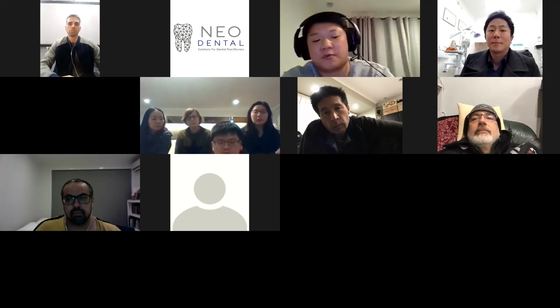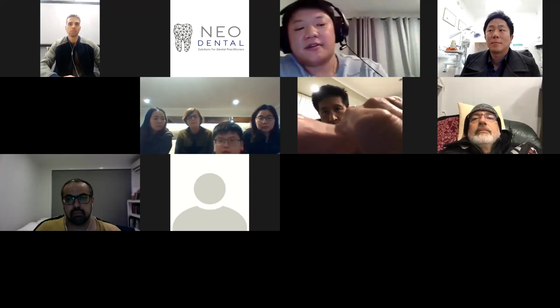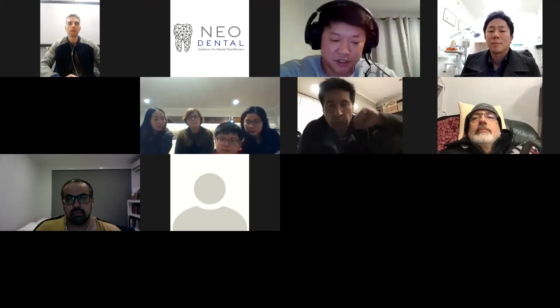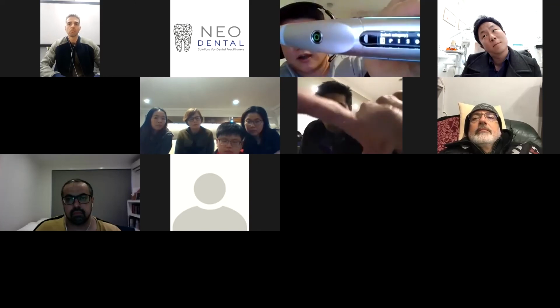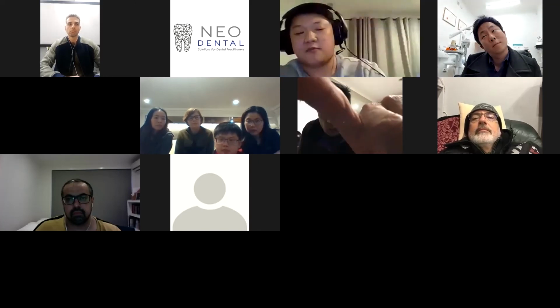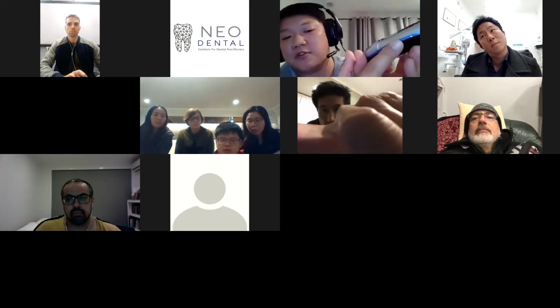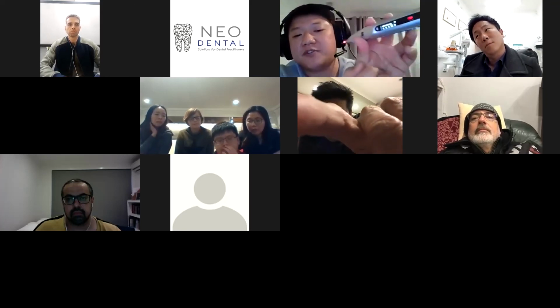You just want to push the circle button again, and then you've got the different modes. You push the circular button again, and then the E will be highlighted. If you want to enter that menu, you push the circle button again. But if you want to go across to the side, that's when you use the arrows. So I personally go across to S, that's my surgery.